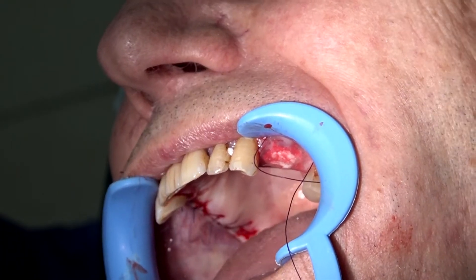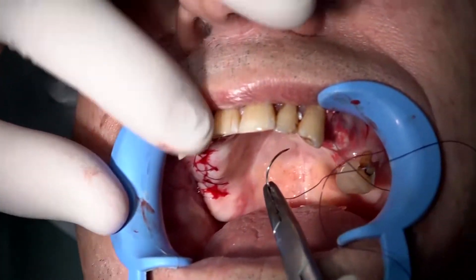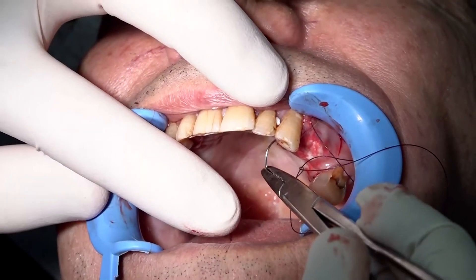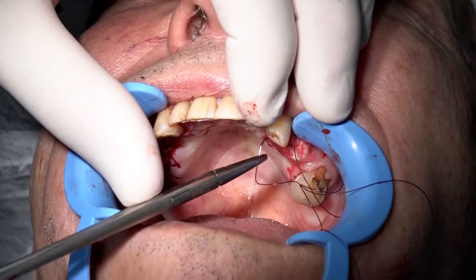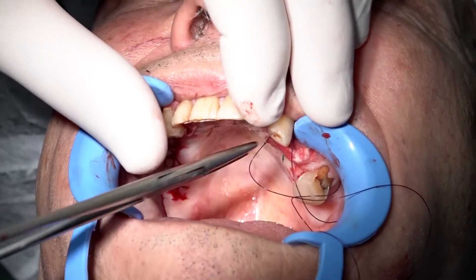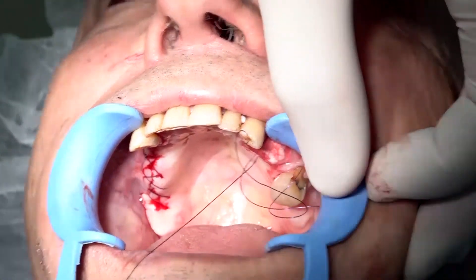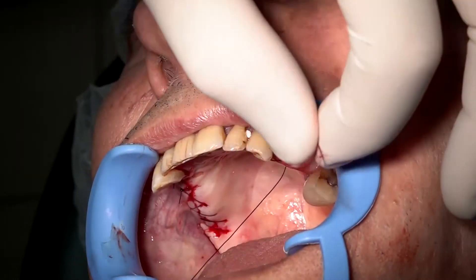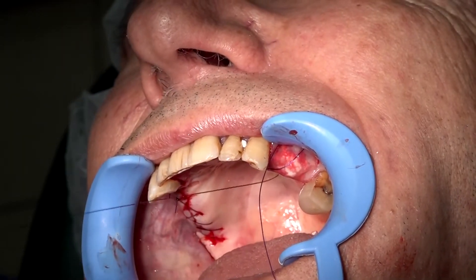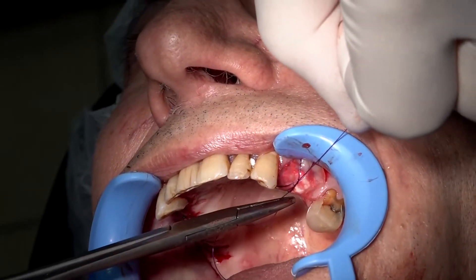Then going by crossing above the band to the other side to the palate area. And again, from side to side, we introduce the needle, take it out, and then do a cross to the other side and make our knot. We tie it properly so that the band will not move.